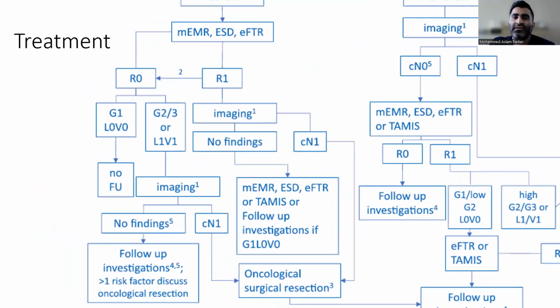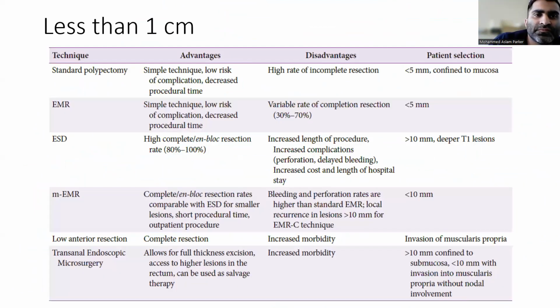So this will actually be quite a large part of the rest of the talk, and it's going to be the lesions that are less than a centimeter. These are often the lesions that we do encounter. There's various modalities which are available, and I'll go through them now.